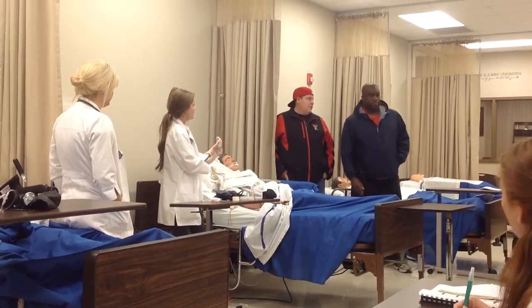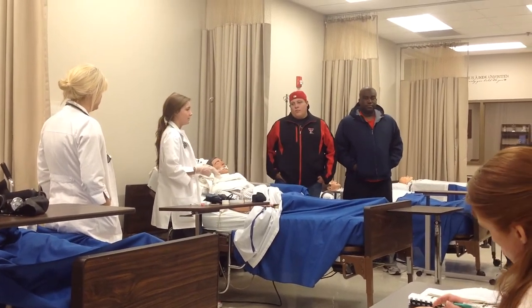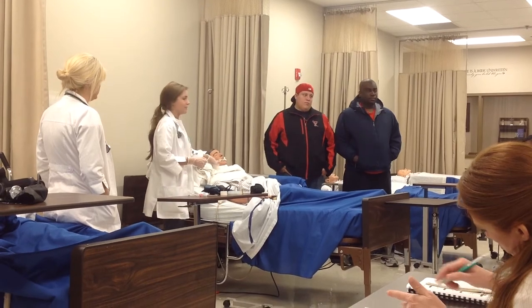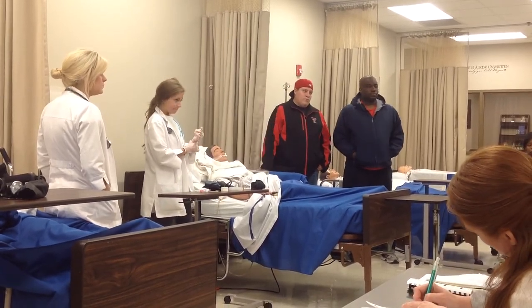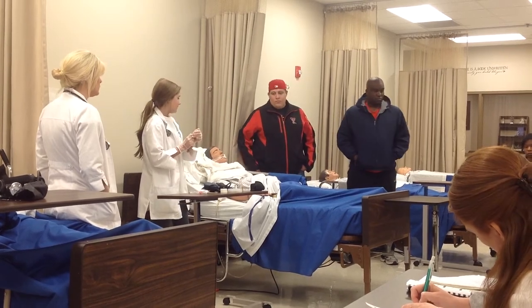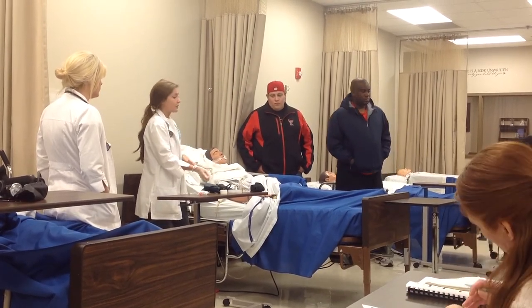She said that already. This is going to be changed once a day. So that's why you have your name, date, time, and initials on the tip. And that's when you would suction and clean them out. Take that out. And then you're going to take your gloves off, wash your hands, and then go document.